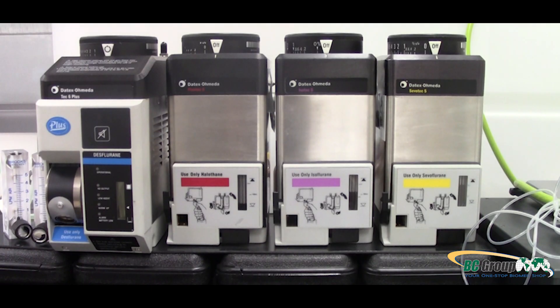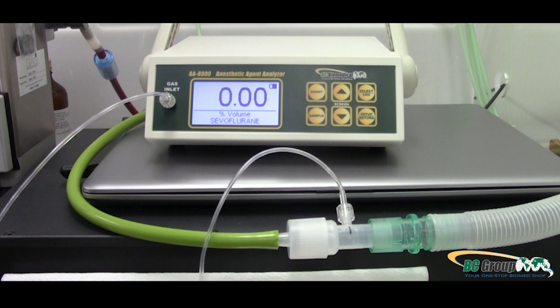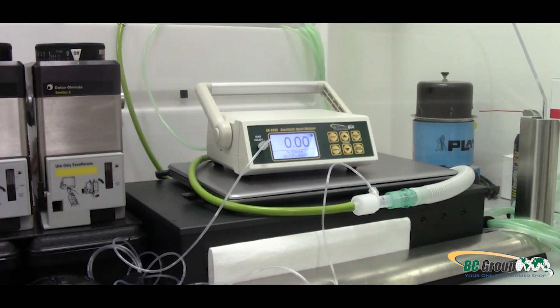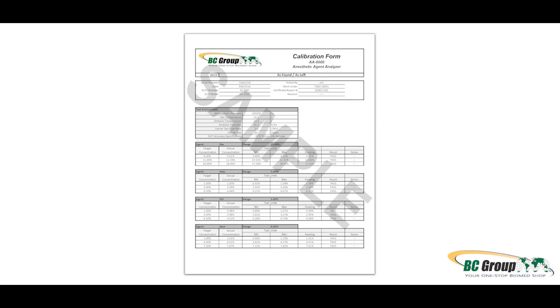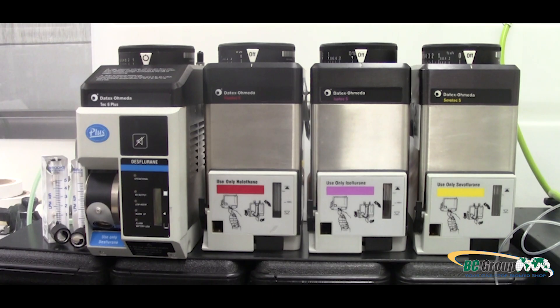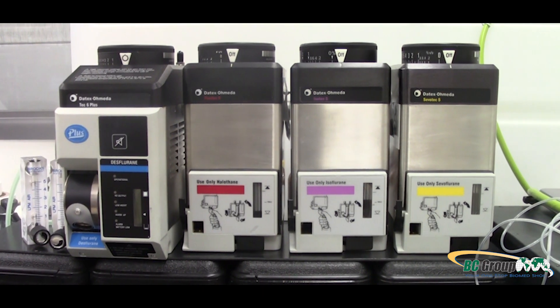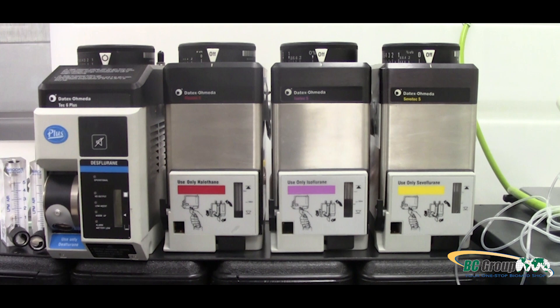To test your anesthetic agents, you will need a sample line, ventilation adapter, scavenger tubing, and the AA8000 Anesthetic Agent Analyzer. The AA8000 includes a 12-point calibration certificate. You will also need a charged anesthetic vaporizer to be tested.